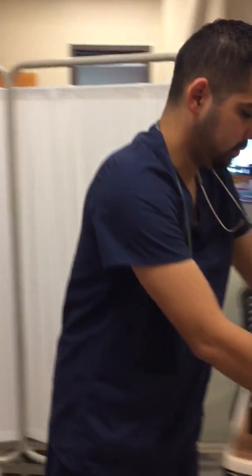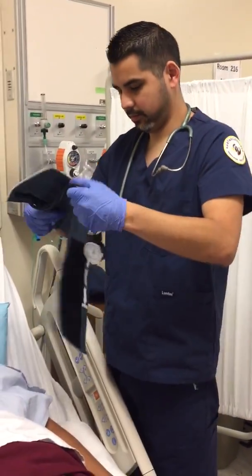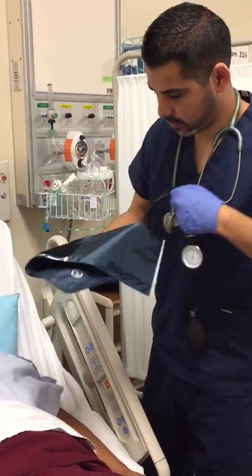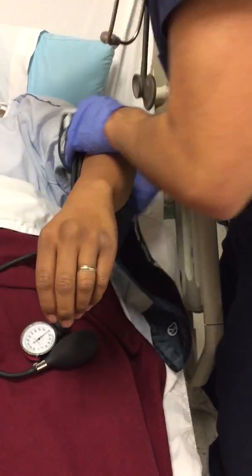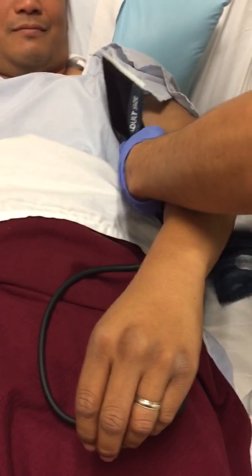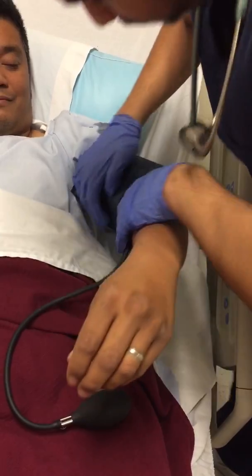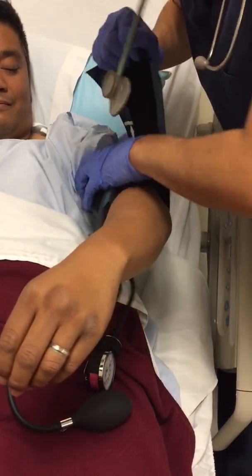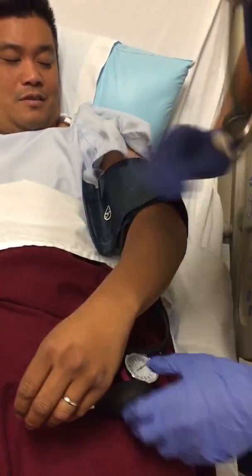Hey, Richard. I'm gonna be doing your blood pressure, okay? Okay, go ahead and put your arm right there. All right, how's that feel? Pretty tight? Feels okay.